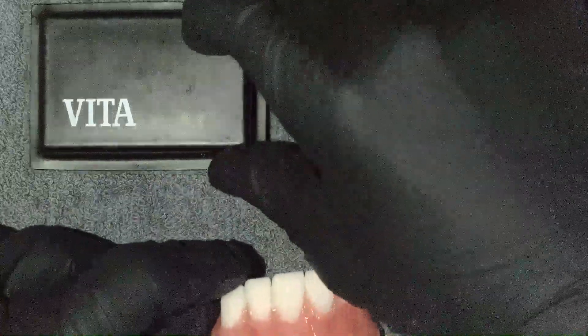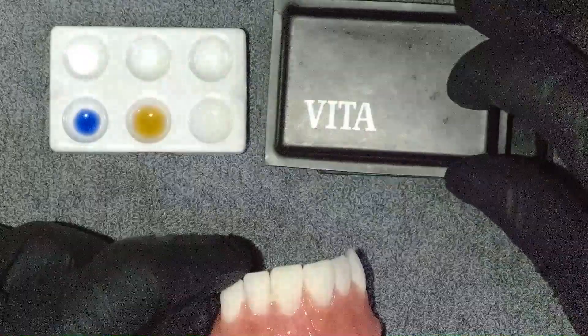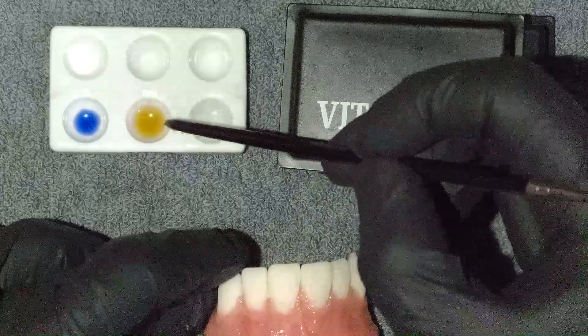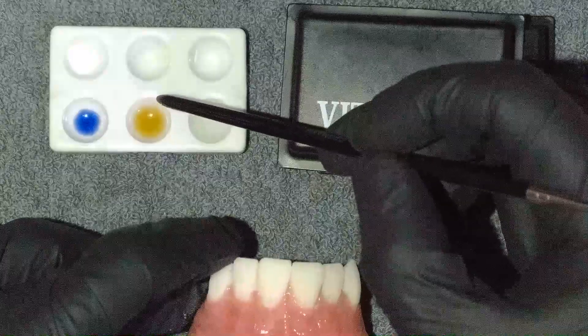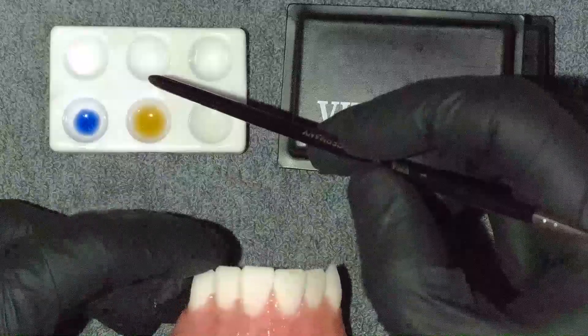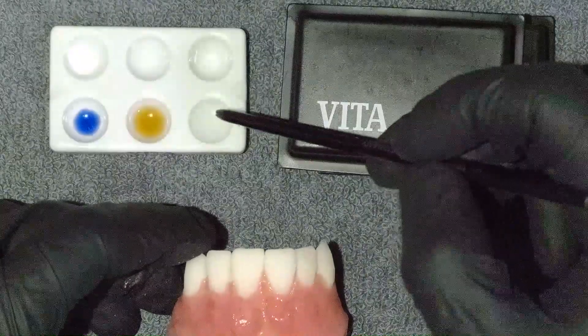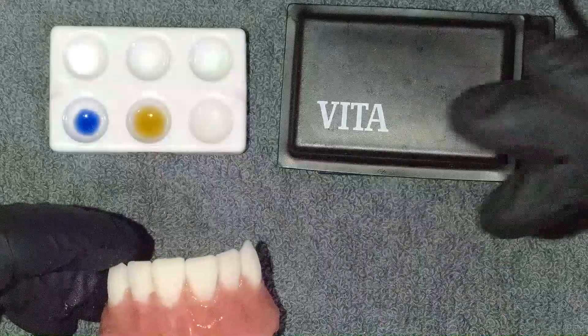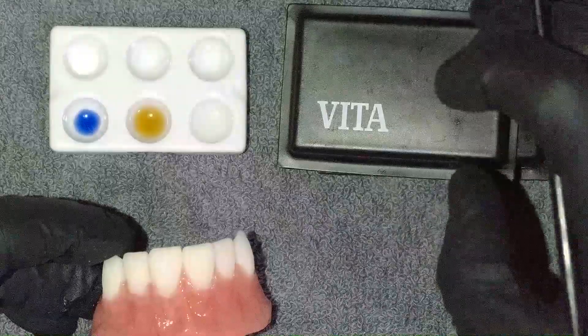For characterizing the teeth, I've got white, blue, and chroma — today I'm using chroma A, but you can use whatever matches the case you're working on. I've also got my glaze. So it's only two colors and some chroma, which is even simpler than the gingival technique.